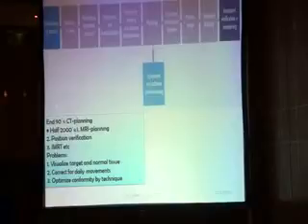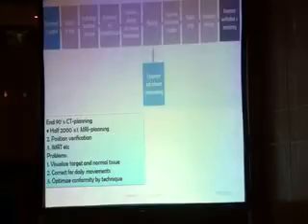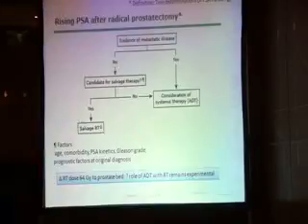By the end of the 90s, we used to use CT planning, and then MRI planning came over. Position verification is important, then IMRT. The problems are to visualize the targets and the normal tissues on a daily basis, and correct for the movement, which is the intrafraction during the treatment, or the interfraction between day after day, and optimize the conformality by technique, which is IMRT, IMPT, or proton therapy.